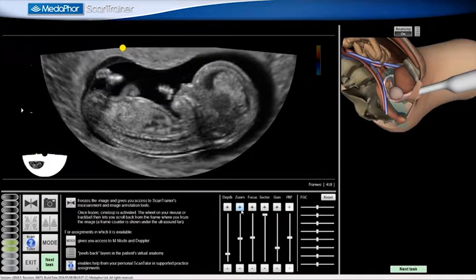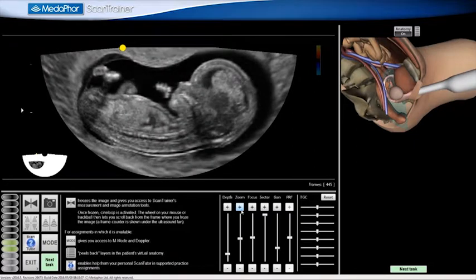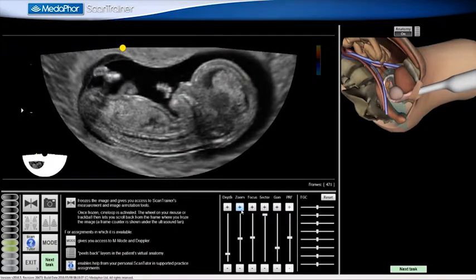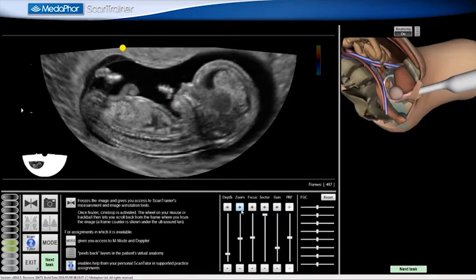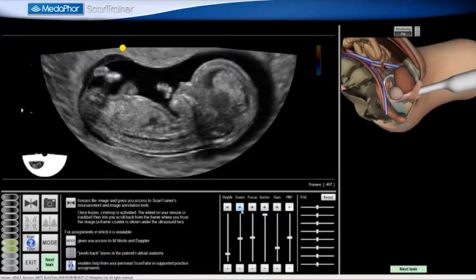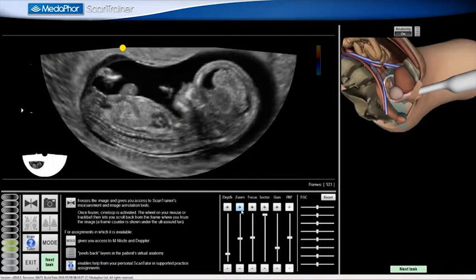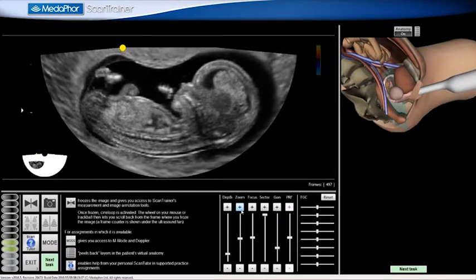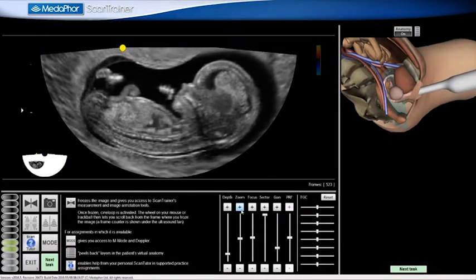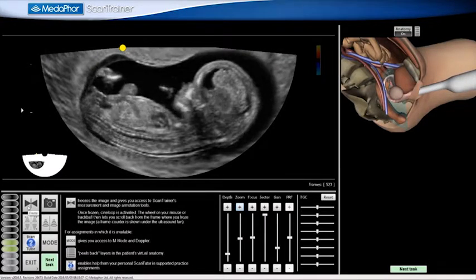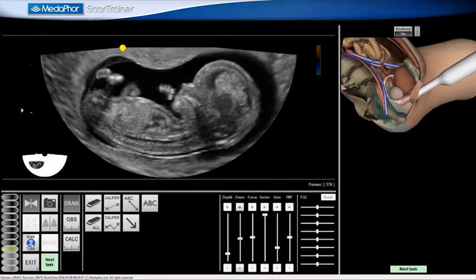I ensure that the fetal head is in line with the full length of the body, and that the fetus is in a neutral position — neither hyperextended nor flexed — and that both the crown and the rump are clearly defined, and that there is amniotic fluid between the crown and the uterine wall and the rump and the uterine wall, and that the anterior maxillary process is not visible.